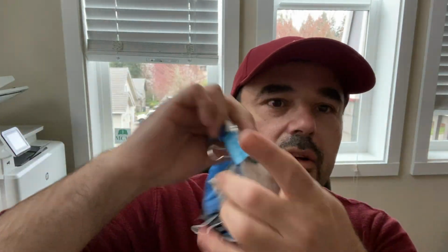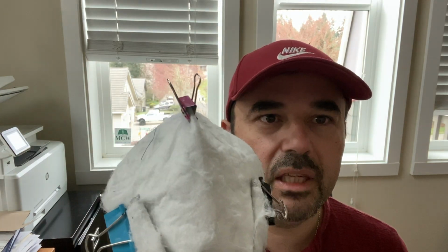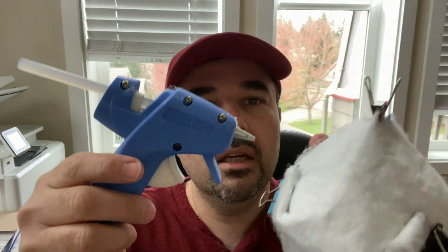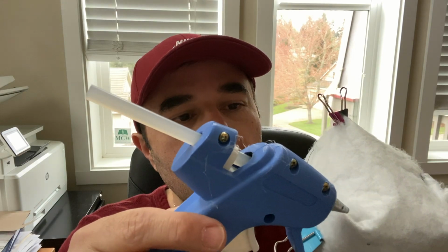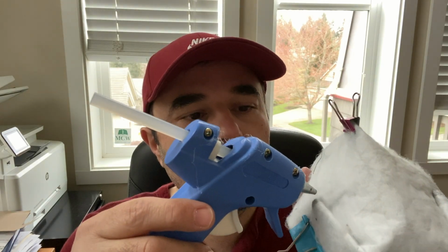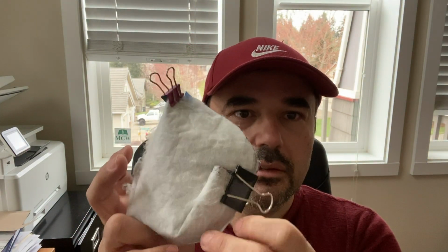So once you've applied your glue, then again, what I recommend is to apply your clip again and let it dry and hold in place there. So you'll want to do that for both sides. So set it to the side, wait a minute or two, let it dry. And then what I would recommend is that you come back and glue the edges. You want to put a little thin rim of glue to really seal the mask. You don't want air to be flowing through these gaps, okay? So you got that. You'll do both sides.